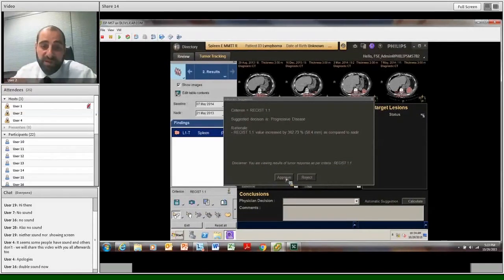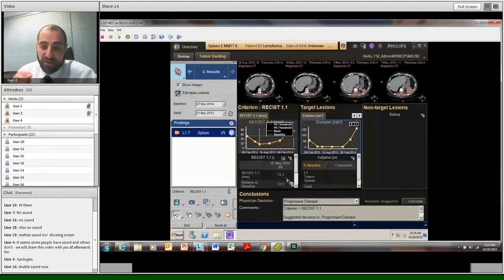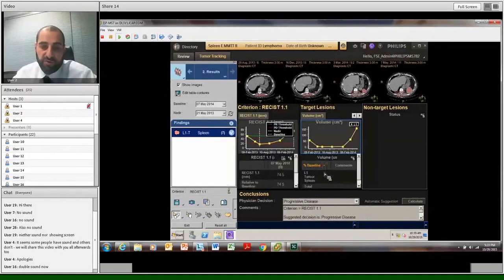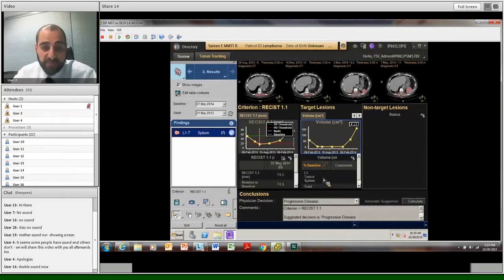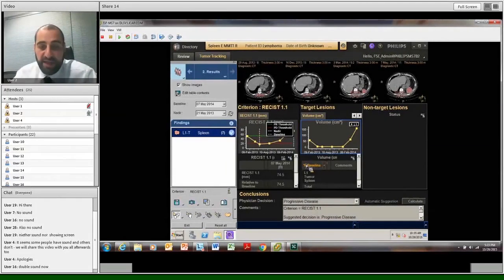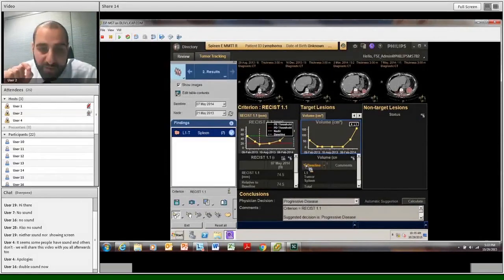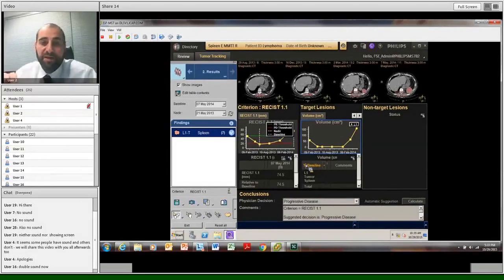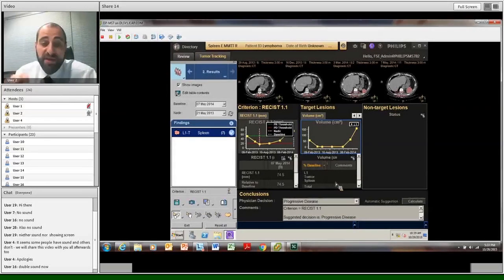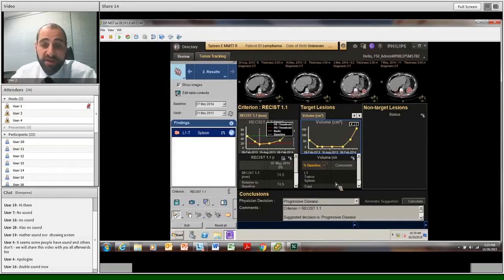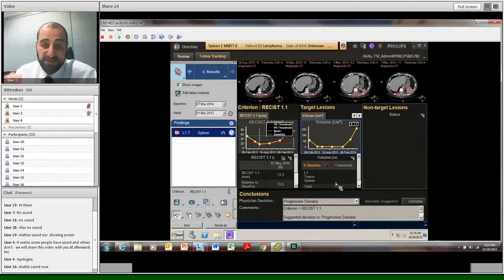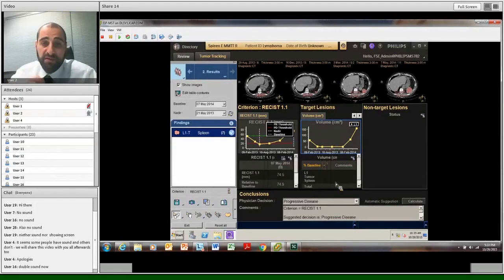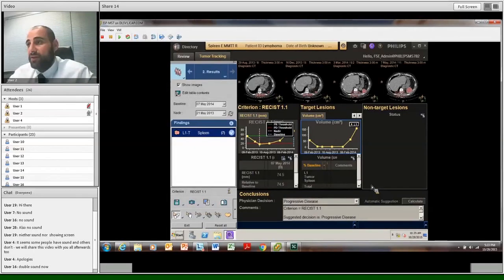I can give consistent results, and it's a lot easier for the referring physician to ask me how has the patient changed over time. And what's even more important, now we can calculate these automatic criteria through RECIST protocol, and it tells me how much has the value changed over time using the RECIST protocol. So for example, it has increased in size since August 2013 to May 2014, which is about seven or eight months. It's now increased by 58.4 millimeters, which is an increase of about 362%. I can approve this, and then I can copy-paste this straight back into my radiology report.